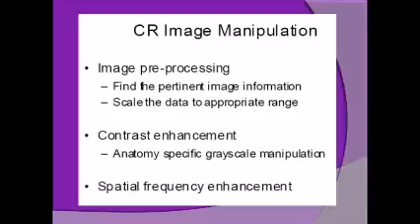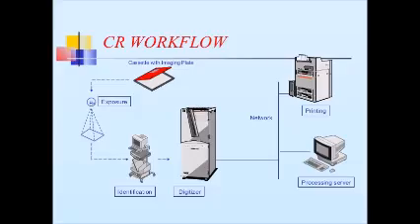Spatial frequency is the sharpness of an image and will enhance the densities to reduce the image graininess. And that is how the CR image is created.